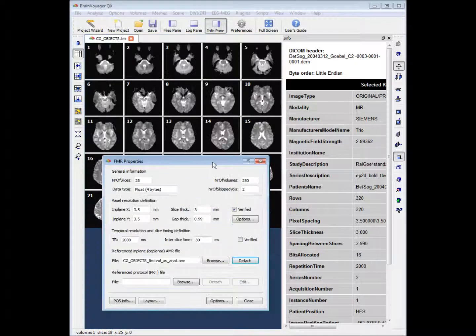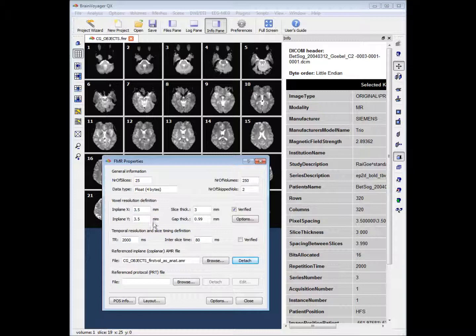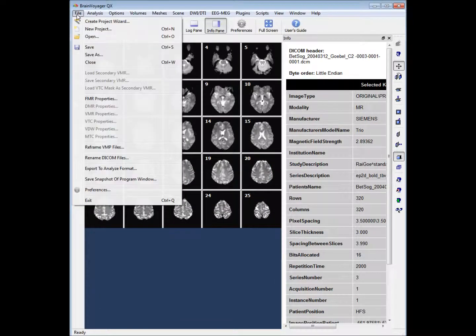Once BrainVoyager has compiled the project, we'll have a dialog box called FMR Properties. It contains information about our scan such as our TR, slice time, and voxel resolution. If you need to find it again, it's under File > FMR Properties.